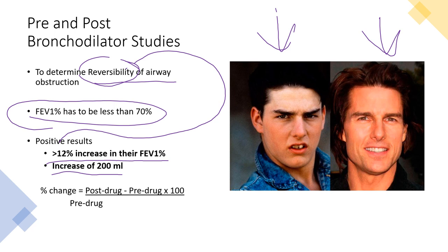So we'll see that percent change, which we've already looked at, percent change pre-drug versus post-drug. And then you move the decimal over two spaces over pre-drug. So this is just your calculation to determine the percent change.